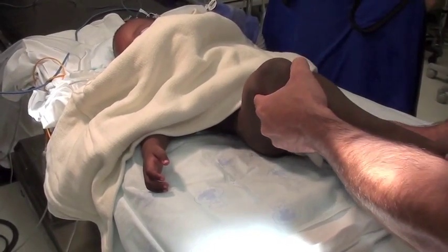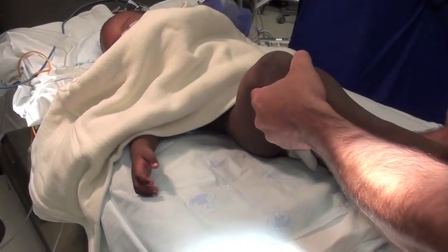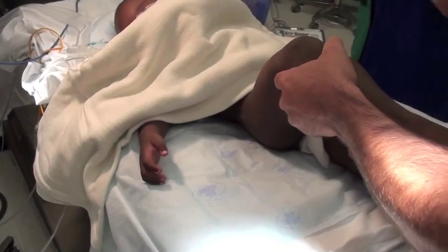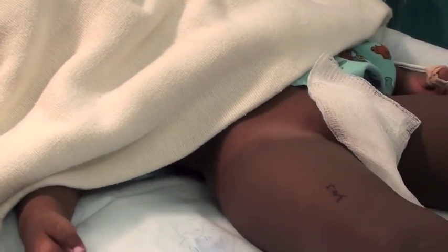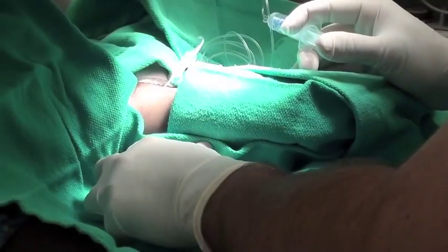The surgeon can gently lift the hip and push it back into the joint. It feels as though it's going into the joint, but dye will need to be injected to determine whether it's actually in the joint or not.